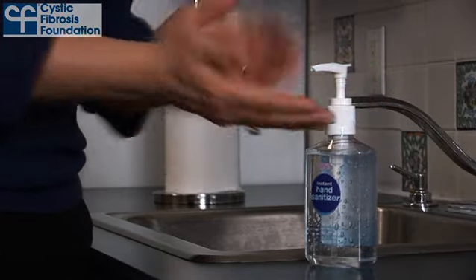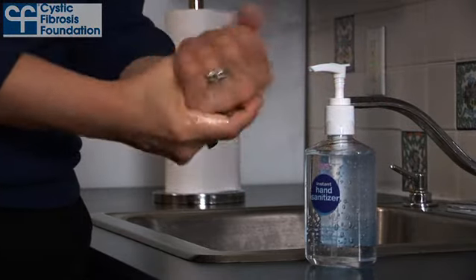First, clean your hands with alcohol-based hand gel or soap and water before handling your nebulizer.